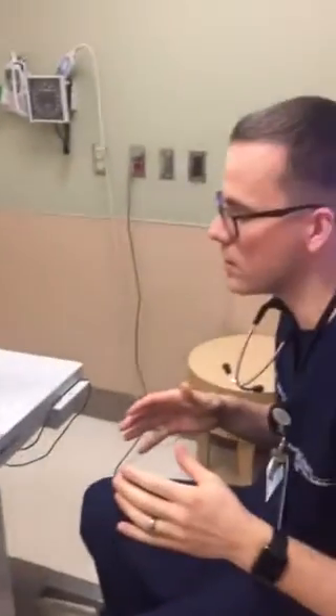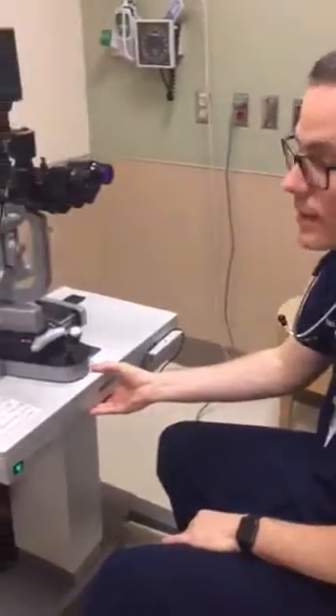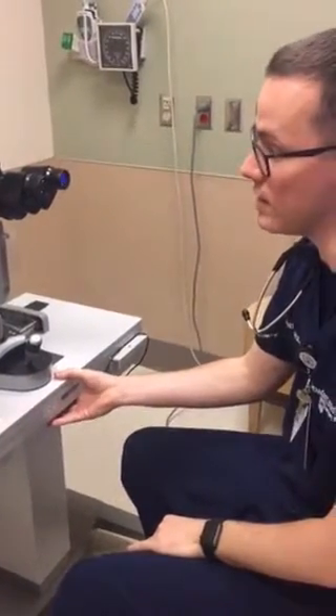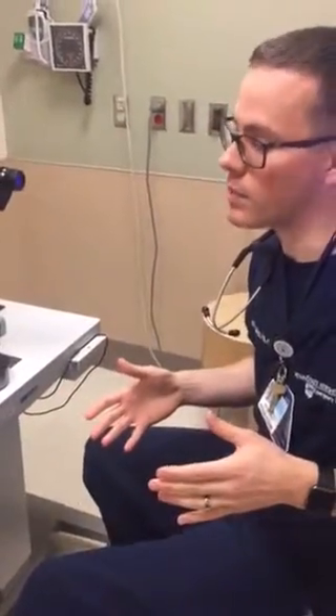With larger patients where something may prevent them from leaning forward, if you lower the slit lamp to a lower height they can lean in more, giving you the ability to do their exam. With children, you can have them sit on a parent's lap or stand. You just want to make sure the patient is in a comfortable position, otherwise you're not going to get a good exam.